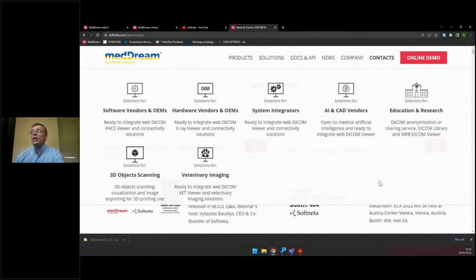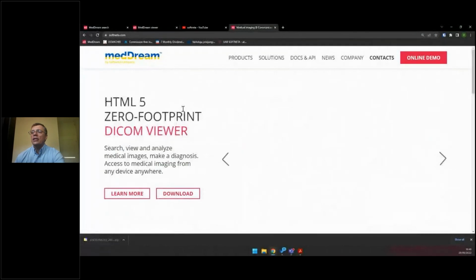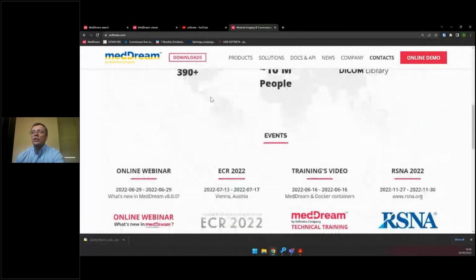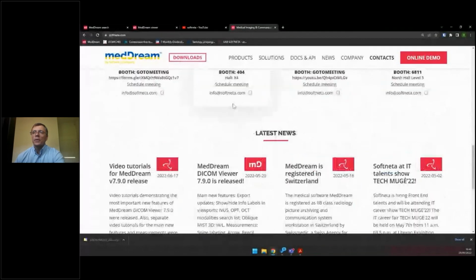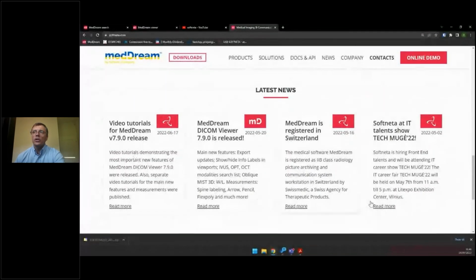And of course, as Renata already explained, it is very important to check our events and our latest news. Latest news will also contain page updates, so this is very informative. Also, what we will discuss now in questions and answers, we are planning in the future to put in our FAQ.